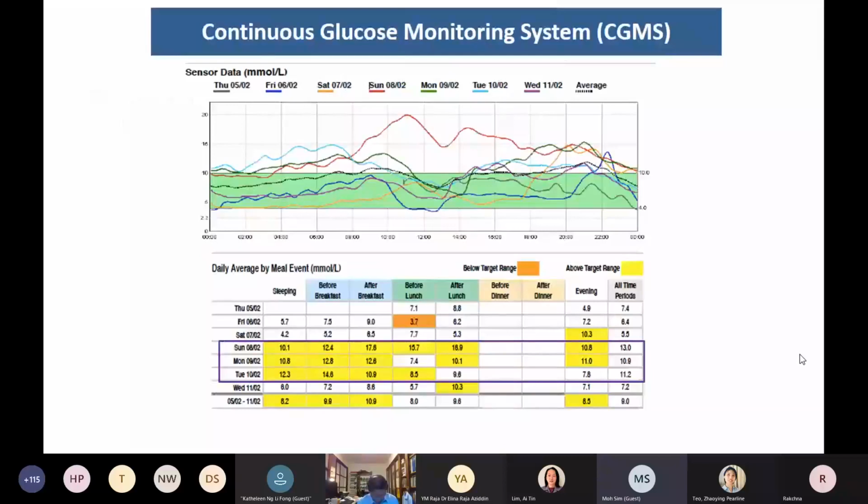So we also recognize that BGM only captures snapshots of a patient's lifestyle. And about 10 years ago, for these patients, we advised them to go on CGMS, continuous glucose monitoring systems, where they wear a sensor, and the sensor actually measures their glucose levels over either 48 hours or, for that matter, a week. And what was happening to this patient was, he was doing BGM during the weekdays. And you can see from the CGMS that all his readings, both pre and post-meal readings during the weekdays, are really very good.